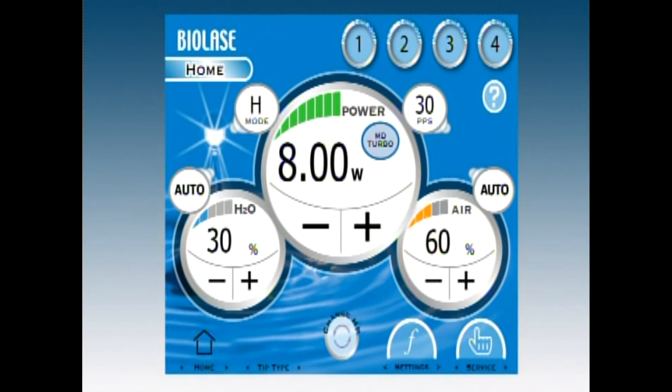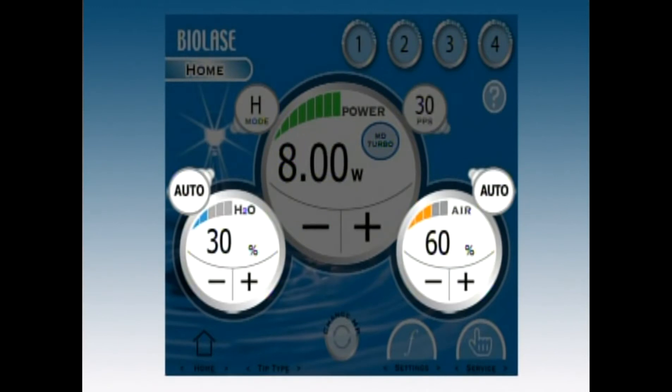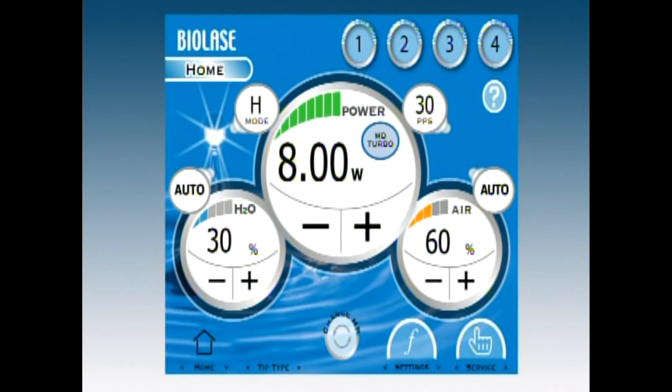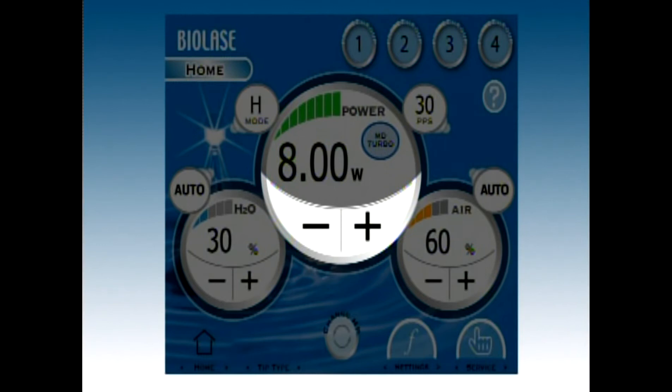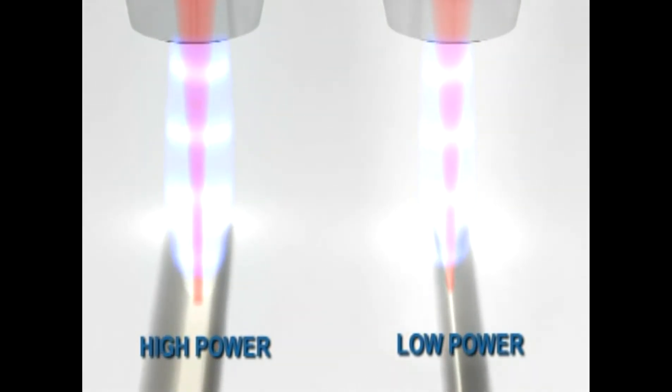No matter what procedure you are performing or tissue type you're operating on, Waterlase gives you complete control with four settings: power, frequency, air and water spray, and pulse mode. When you understand how each of these settings affects cutting, the laser is simple to use. These buttons increase or decrease the amount of laser energy coming from the tip. Using high power between 5 and 8 watts will produce deep cuts, and using powers between 3 to 4 watts for a shallower cut.